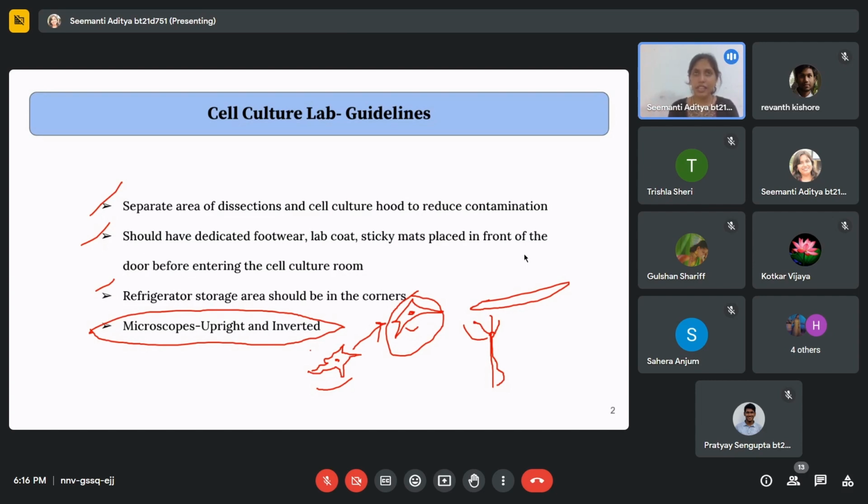Other than that, fungus, bacteria, and viruses. Viruses also, it is not very easy to detect. For different kinds of viruses, definitely if there is a virus contamination, cells are going to burst. They are not going to stay whole. It's going to be like small fragments of cells.